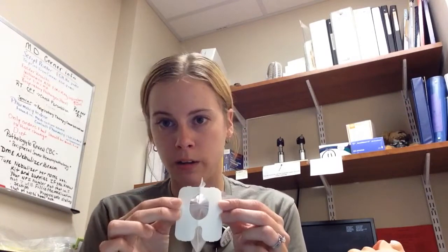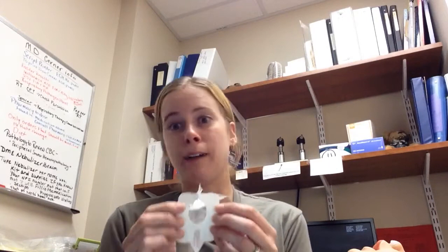Also, getting it to stick. I will say that the area will need to be cleaned off and you will need to pat dry and you need to make sure it is 100% dry before placing this on. And also checking it. You need to check this every half hour. The sooner that you can get it off and get the urine down to lab, the better. Also, a lot of the times it'll spill in the diaper the longer it's left on there. And then also, if you just put this on, please check it before they come up to the peds unit. Cath UA.